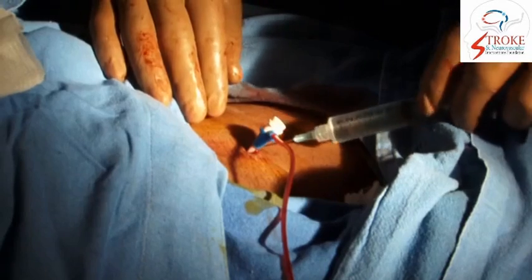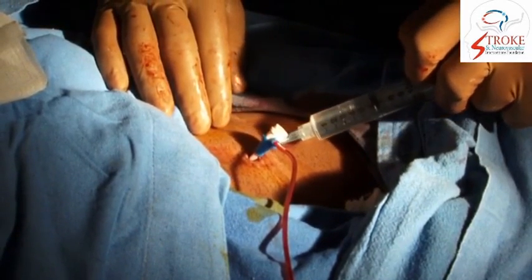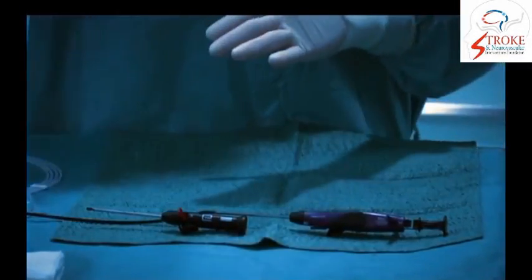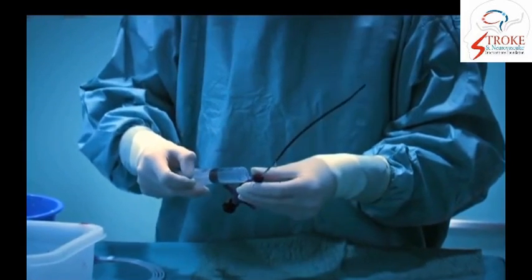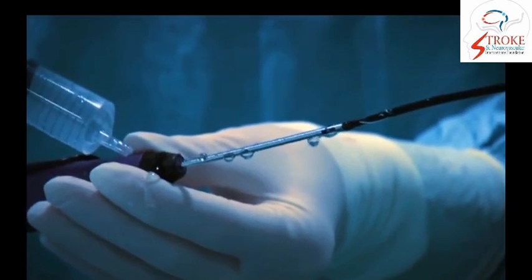We have removed the guiding catheter and now we'll remove the sheath and using a closure device, the Perclose system. This is the Marker lumen being flushed.